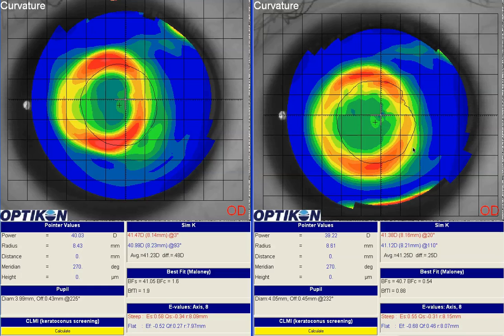We're still a little bit decentered. We've got temporal decentration, and it's in both eyes. The zone is more spherical, and at least we've extended the nasal edge of the zone a little bit outward, more away from the pupil. So it's possible that eyelids could be just pushing the lens, and we may not be able to get full centration, but the new treatment zone does look a little bit better.